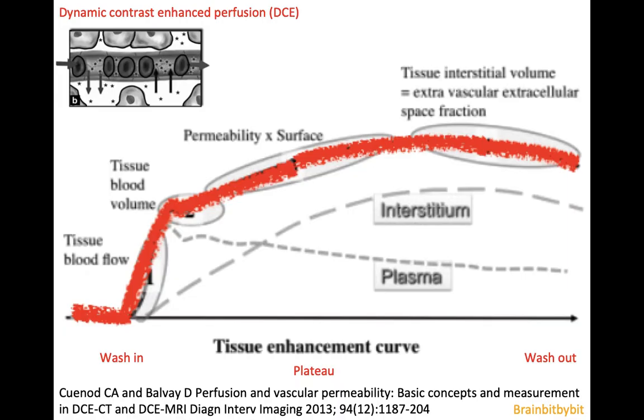In oncology, MR is the primary imaging method, and there are also two MR perfusion techniques that I want to discuss. The first one is T1 based, and it's called dynamic contrast enhanced perfusion. And in tumors, there's angiogenesis, and these new vessels are leaky. So if you administer contrast, you're not only looking at the perfusion of the tissue, but also at contrast leaking from the blood vessels to the interstitium and extracellular space.